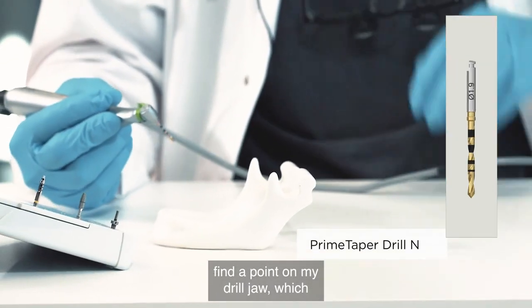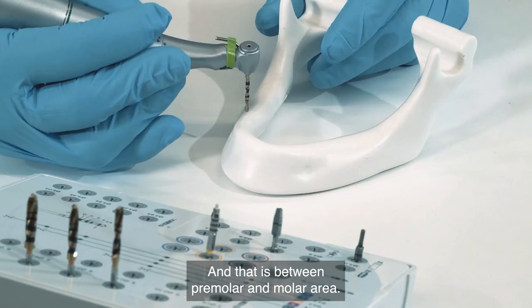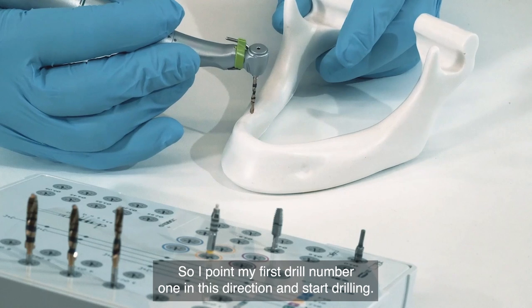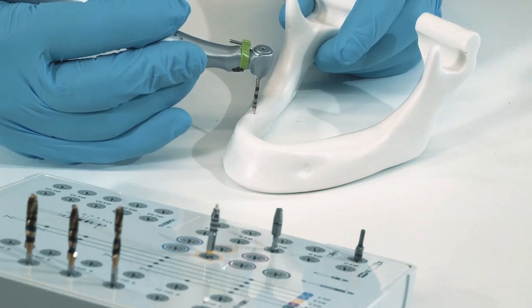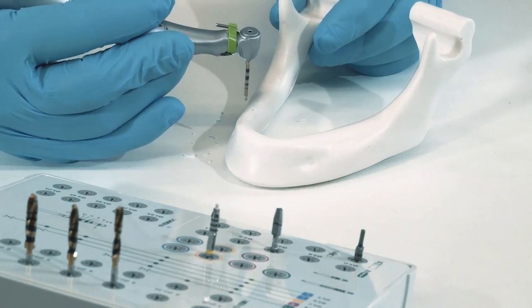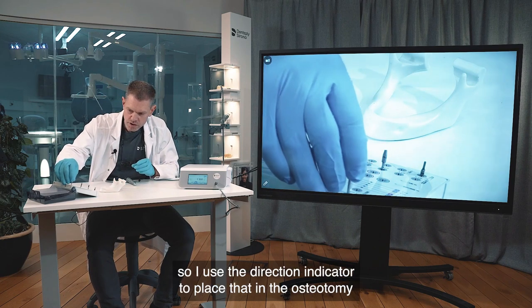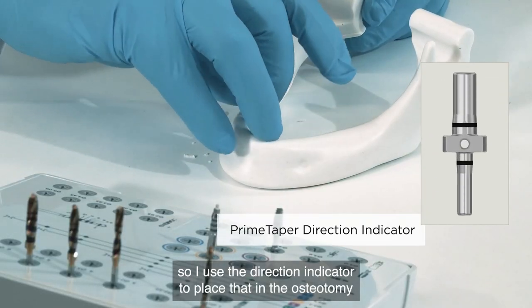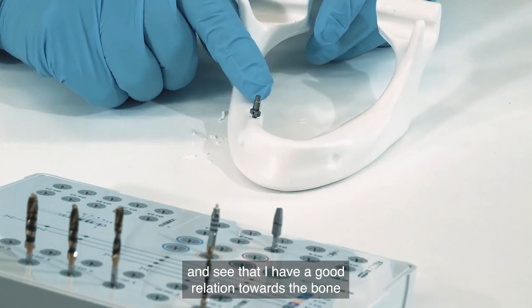I take drill number one and find a convenient point on my drill jaw — between the premolar and molar area. I point drill number one in the correct direction and start drilling. Then I check my angulation using the direction indicator, placing it in the osteotomy to verify a good relation to the bone and anatomy.